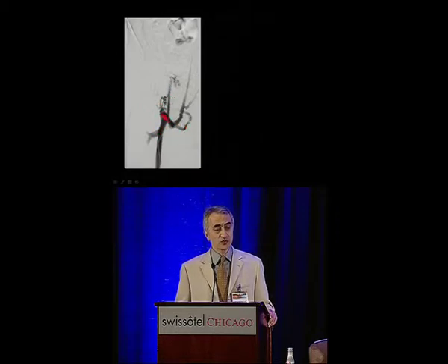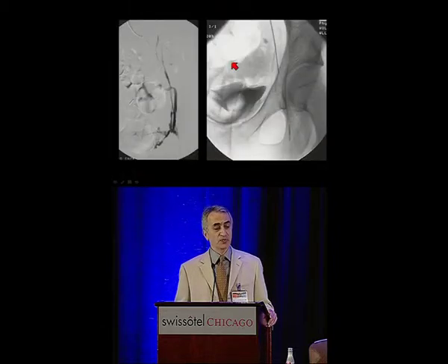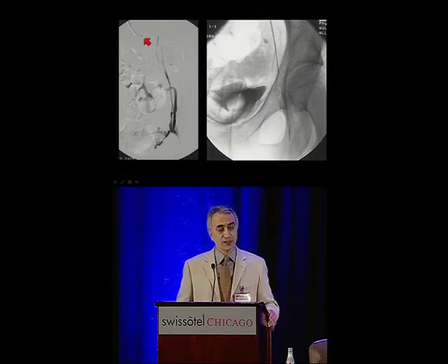Clearly, it's not these two, or is it in here? It's hard to know. A different projection shows that this clearly was not the case. And in fact, the main channel was somewhere in here. We could not recanalize from below, and so we approached this from above. Patient was turned around, and here's a guide catheter sitting here for better support. And this was recanalized down this path into this area, and we had a meeting from above and below.